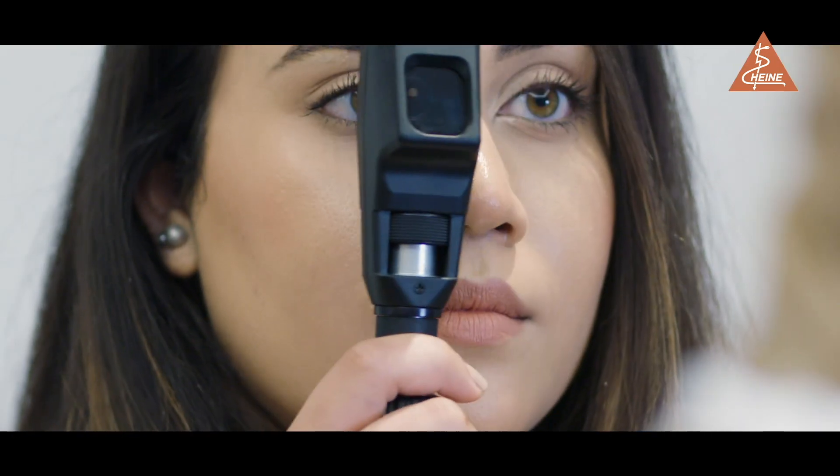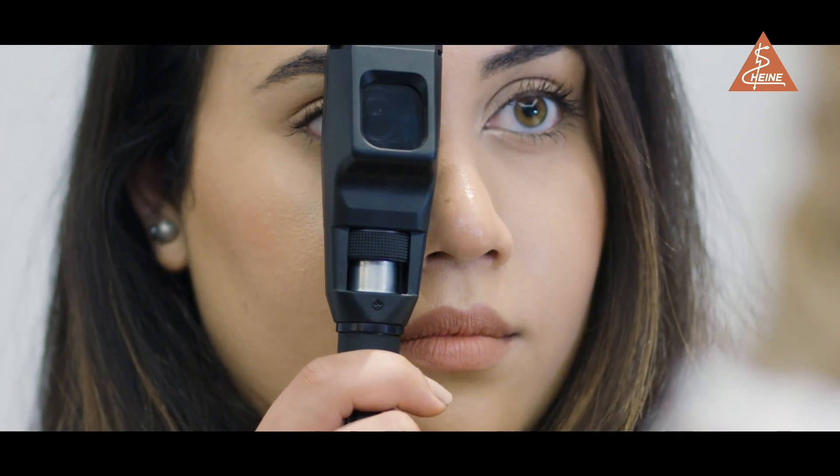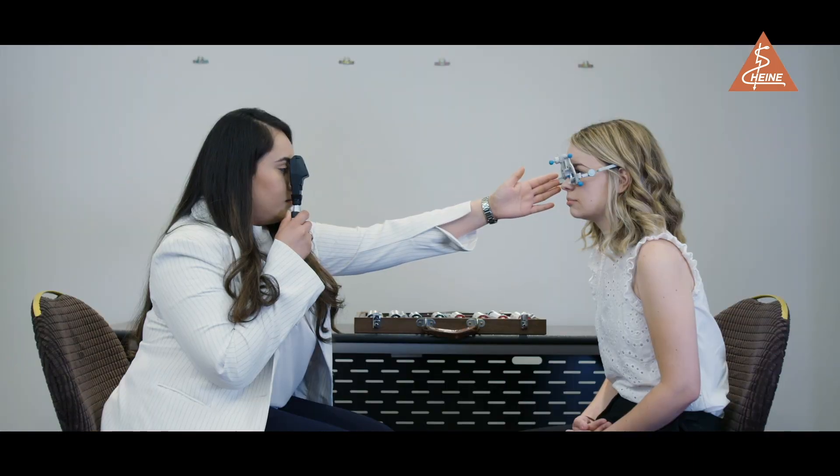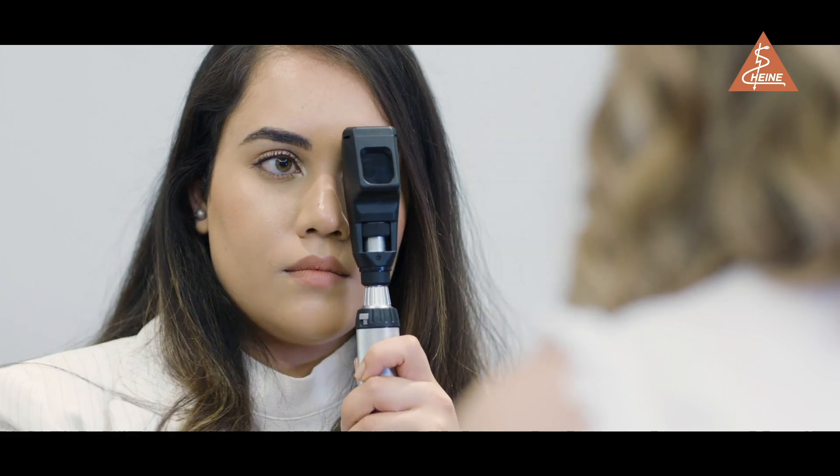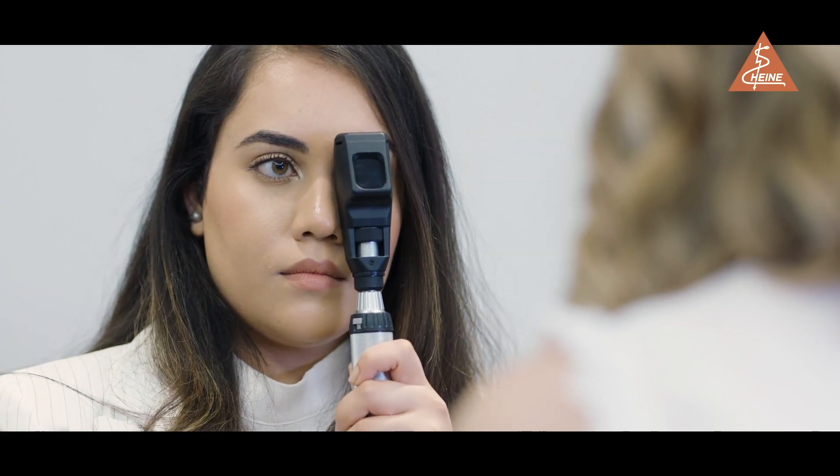For examining the right eye, the practitioner should be situated on the right-hand side of the patient, use their right eye, and hold the retinoscope in their right hand. Likewise, for examining the patient's left eye, use your left eye, hold the retinoscope in your left hand, and approach the patient from the left.